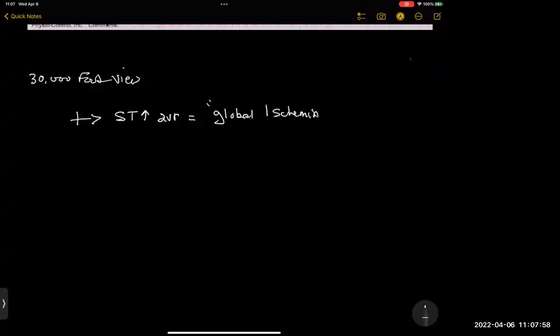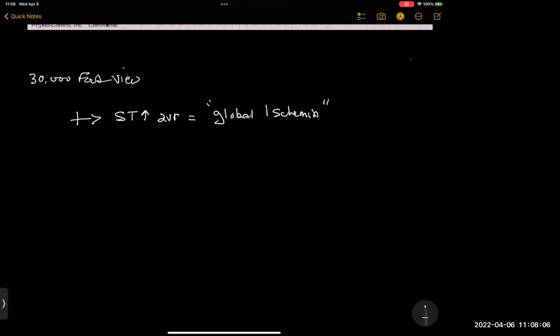That is to say, to see that fire from the top of the mountain, there has to be a lot of smoke coming up for you to see it, right? So to see ST elevation in AVR suggests that something is impacting a significant portion of the heart, even if you can't localize changes that meet STEMI criteria. That ST elevation is like, hey, there's something going on globally.